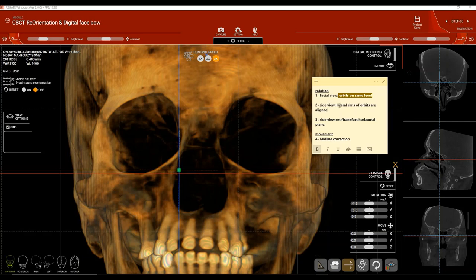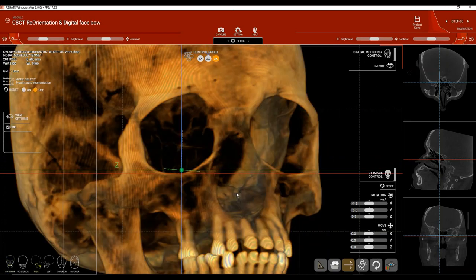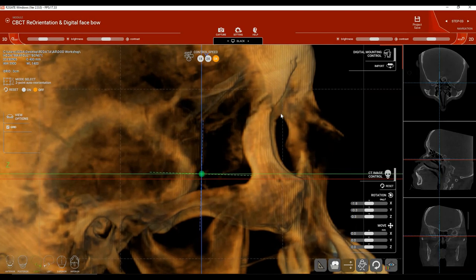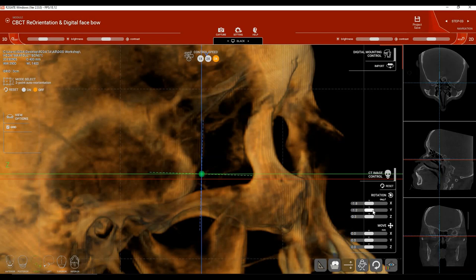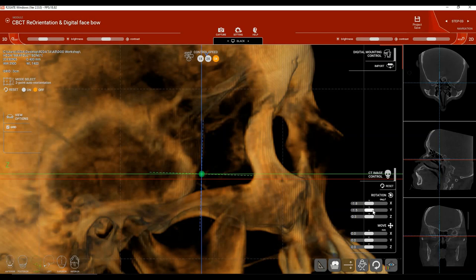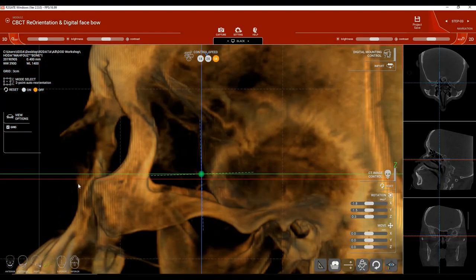From a side view, make sure both lateral rims of the orbits are aligned. If they are not properly aligned, use Y to rotate the patient's head to the right or to the left. To ensure both orbits are perfectly superimposed, look at the patient from the left view as well.